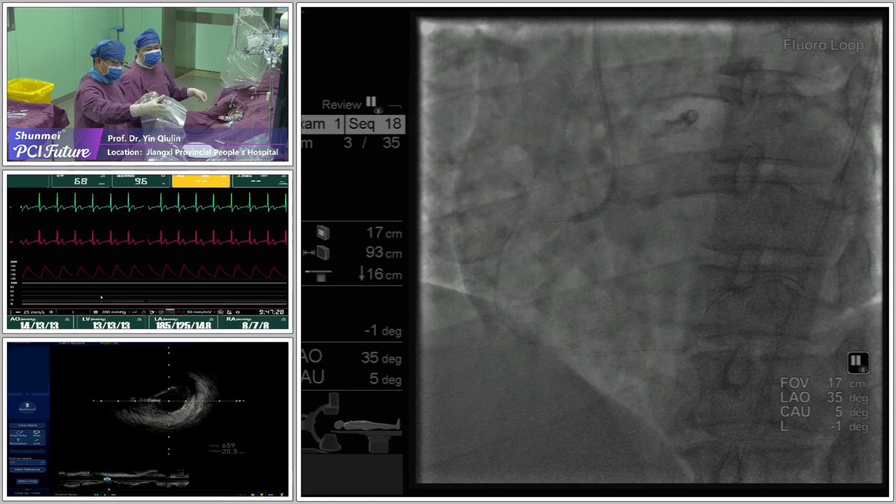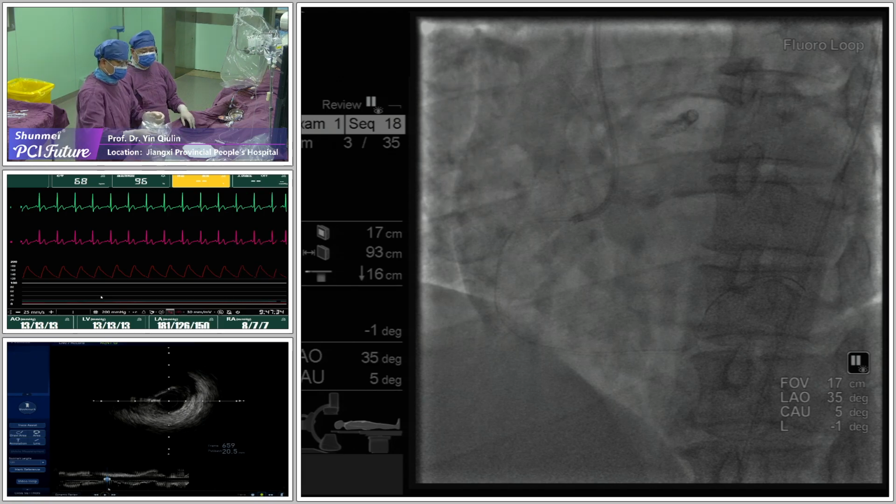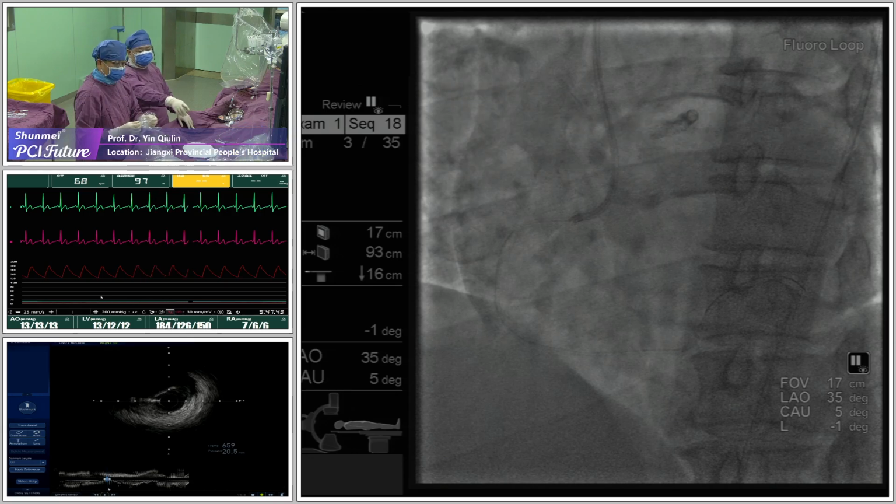Those two with the knuckle. I would be very cautious to disrupt that area because that would make the retrograde options very, very difficult. Alex, you were saying something. Yeah, so I think here I agree there is no other option than ADR or retrograde. So then you need to choose between.